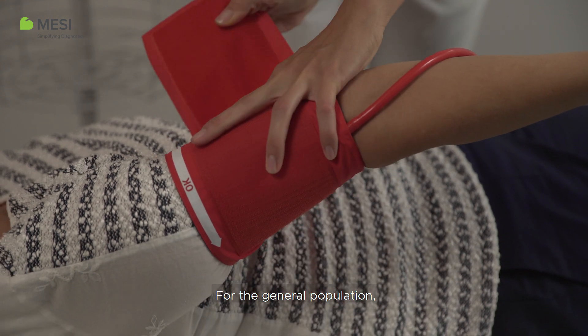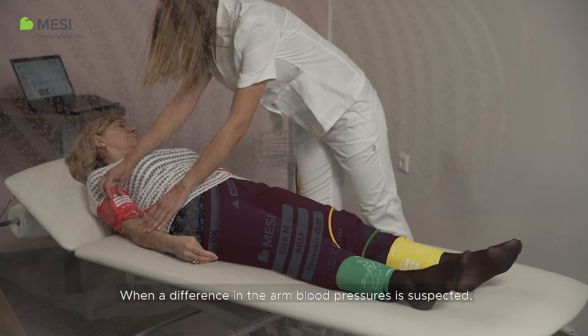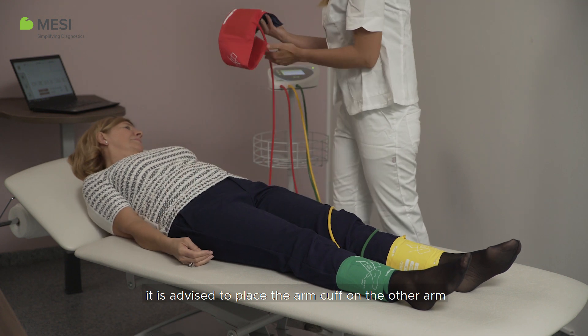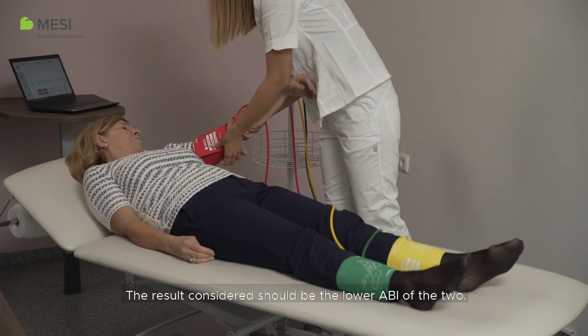For the general population, performing a three-cuff measurement is sufficient. When a difference in the arm blood pressure is suspected, it is advised to place the arm cuff on the other arm and repeat the measurement. The result considered should be the lower ABI of the two.